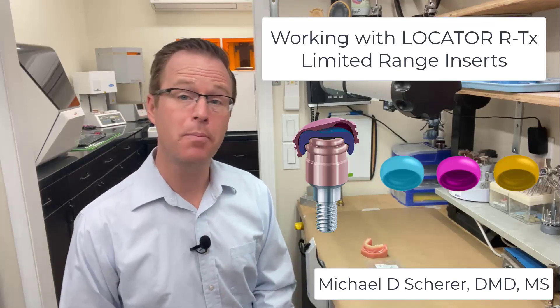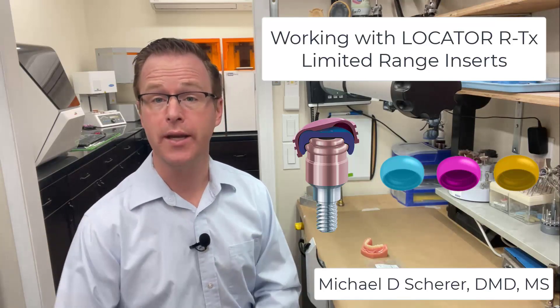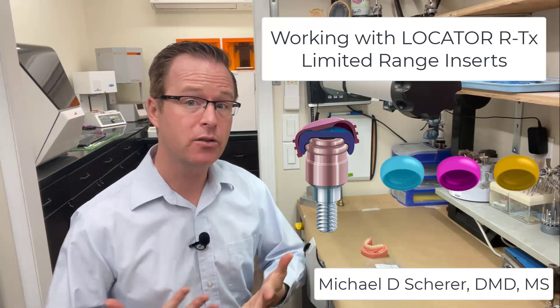Hi there, this is Dr. Michael Shearer with LearnLocator. In this video, we're going to be taking a look at some of the new innovative features that are available for the Locator RTX system.